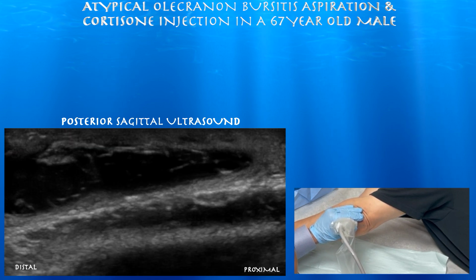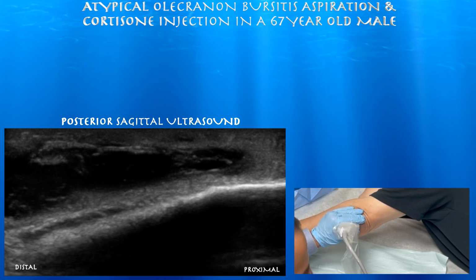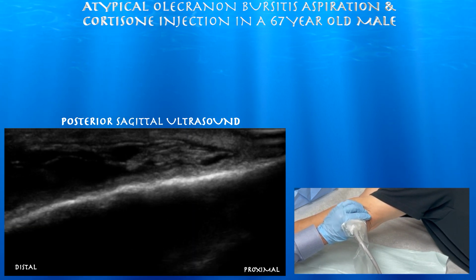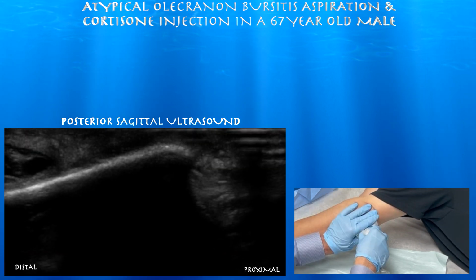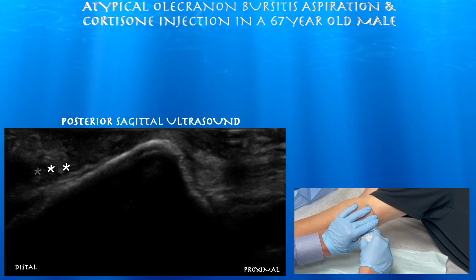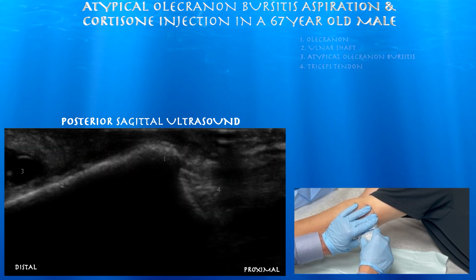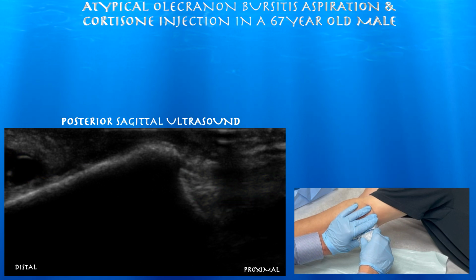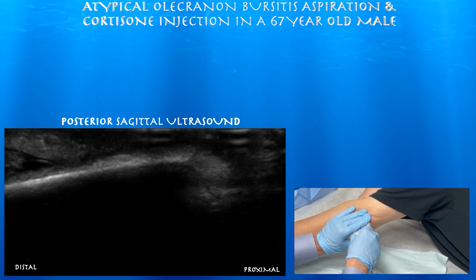Here we're looking at a sagittal view of this very large fluid collection over the posterior aspect of the proximal forearm. I believe this is an extension of an olecranon bursitis. As you can see, a little bit of a tract here going up towards the olecranon. So I believe this is an atypical olecranon bursitis, which you can see here in red, and the triceps tendon is in green. And when he first had this, it was actually a typical olecranon bursitis.